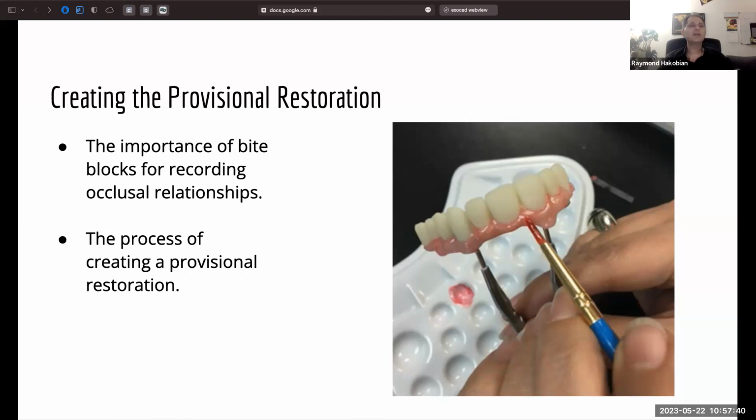The picture shows how we create that color with the paint coloring. I use the Shofu company's coloring paste to finalize the case, then glazing. Actually, we are doing the stain and glaze.